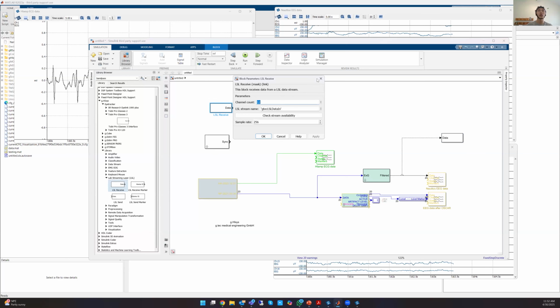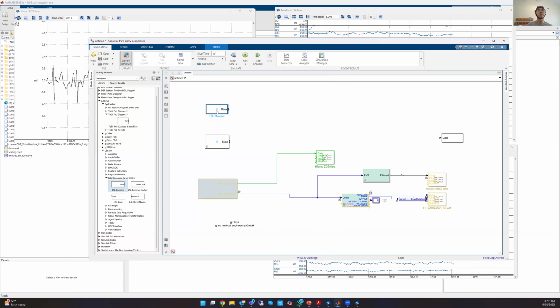You can define the LSL streaming layer, receiving the signal from that third-party device, combined with our model in real time. Or you can use a trigger cable connecting to one of the amplifiers itself. The data can be hardware triggered together or combined through a hardware cable. So there are many different ways to combine multiple devices for one experiment.